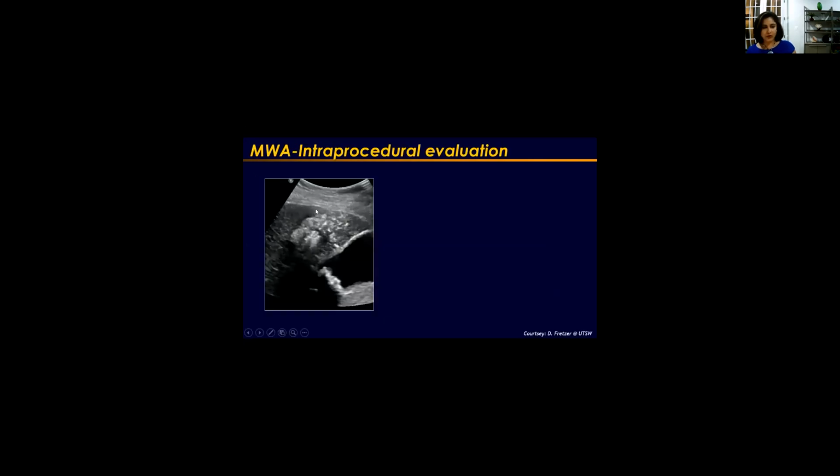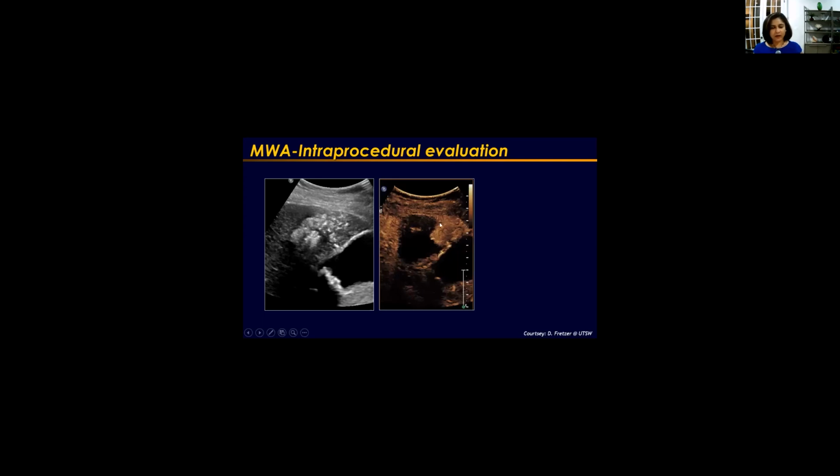So this particular tumor was treated with microwave ablation, and right now we see an ill-defined gas cloud owing to outgassing of water vapor due to deposition of high intensity energy. But if we wait, after 20 minutes or so, this cloud of gas disappears, and we can give contrast and identify then and there during the procedure whether there's any residual tumor or not. Sometimes the contrast agent gets suspended within these gas bubbles, and we can destroy them by using what is called a flash pulse available with contrast ultrasound software.